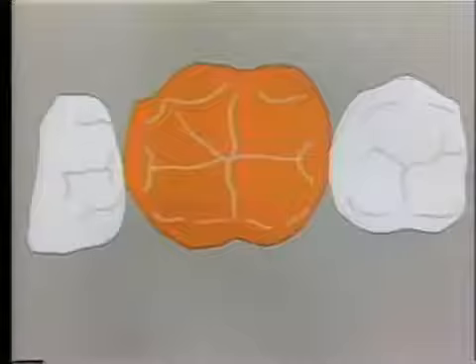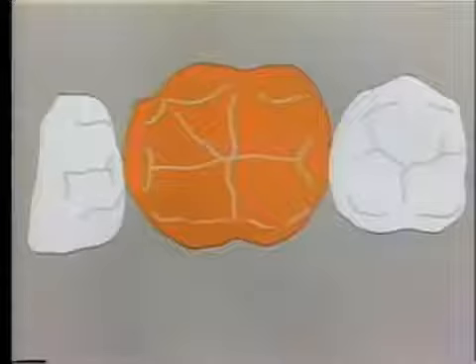Other changes which are made in the natural tooth form for a posterior Pontic can be seen from the occlusal surface, and this diagram shows the occlusal surface of the first mandibular molar that we looked at previously. The buccal surface of the tooth is towards the upper boundary of the screen. The lingual surface is towards the lower boundary of the screen. The modification which is made in converting the natural tooth form to a Pontic is to taper off the mesial and distal surfaces of the tooth on the lingual surface. In this way, the interproximal embrasures on the mesial and distal are opened, and better access is given to the underlying tissue and to the retainer margins.